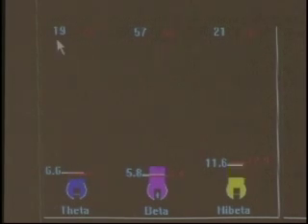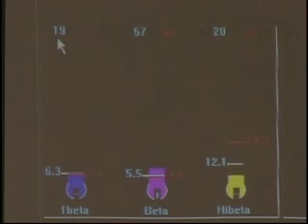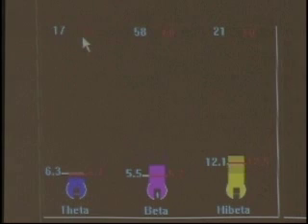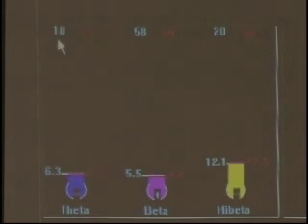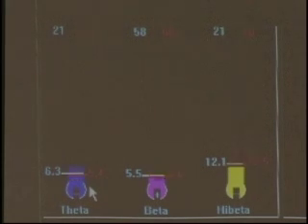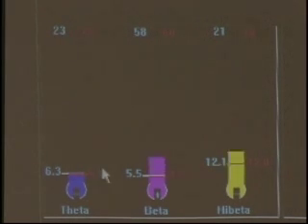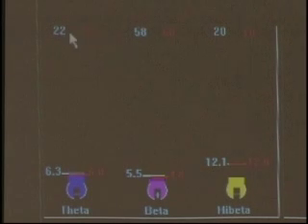The blue number represents the actual percent time above threshold at this moment. If we leave it running long enough, it'll bring the values up to the target numbers. So we have: preset target and actual — where we are now. The options are: after pre-baseline, set the threshold; and after each run, set the threshold. Those are the times when threshold changes happen, and feedback based on that will help keep these two values close to each other.